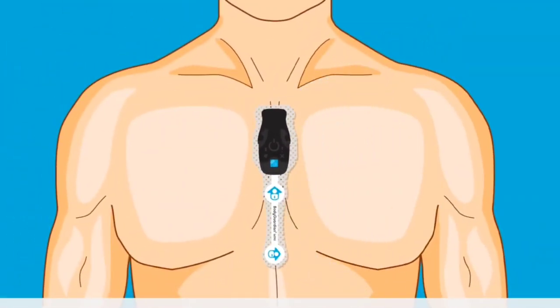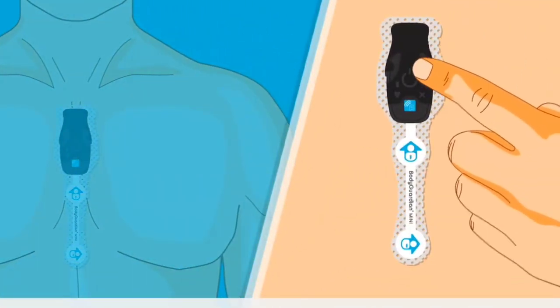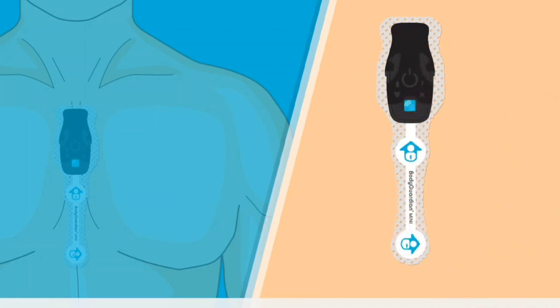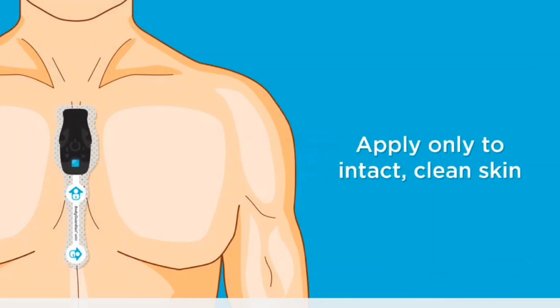Then place the strip and monitor flat on your chest vertically. Press around the surface of the strip against the skin to ensure the strip adheres to the skin. Apply only to intact, clean skin. Do not apply over open wounds, lesions, infected or inflamed areas.